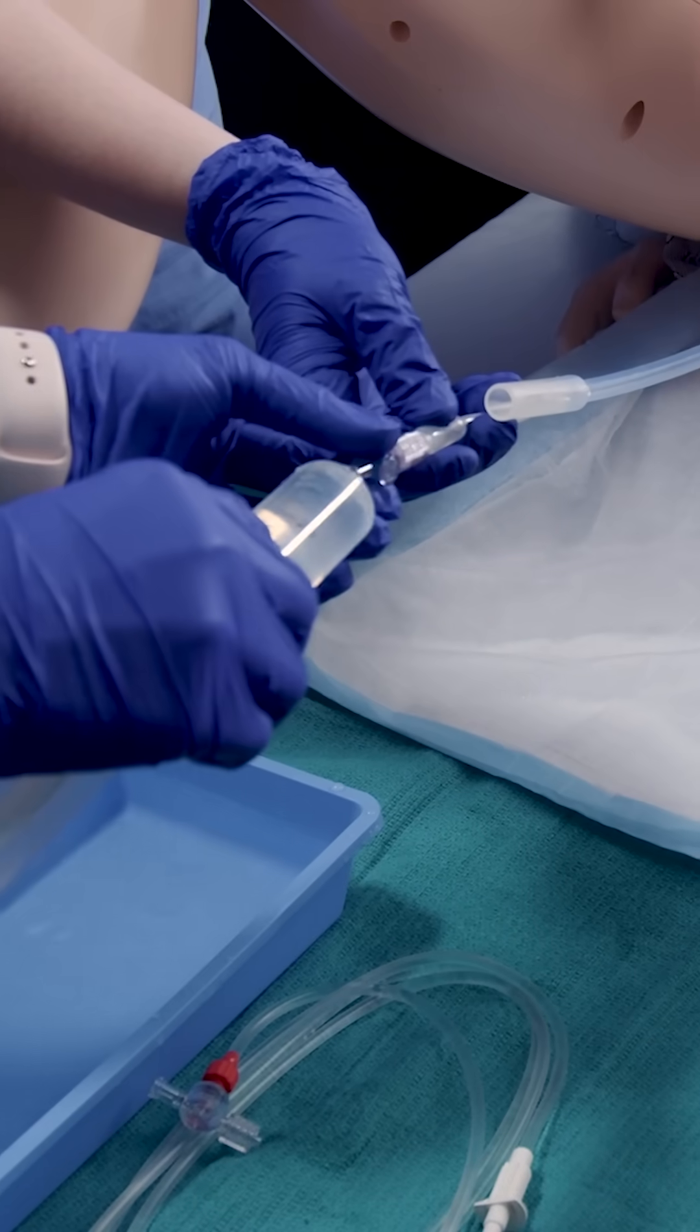As my assistant is instilling the saline, I'm making sure that the Bakri balloon is still seated properly in the uterine cavity.